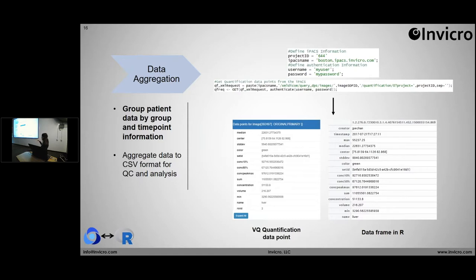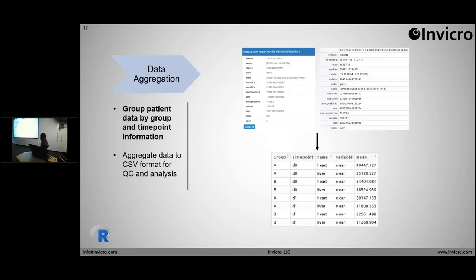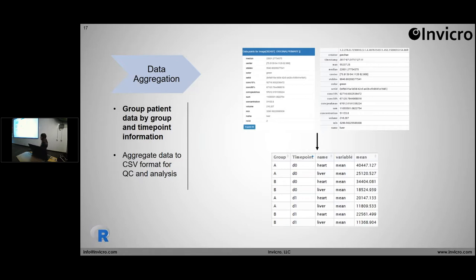It's the exact same information — you can pull the quantification information as well as the associated metadata. Now that you have it in R, you really can do whatever kind of manipulation you want. You're going to grab all of your quantification data points for all of your images, and then group that information by group name, time point, and ROI. Because R is optimized for data analysis, grouping is very simple — single one-line functions allow you to do this easily. You take those individual data points and turn them into group-level information.